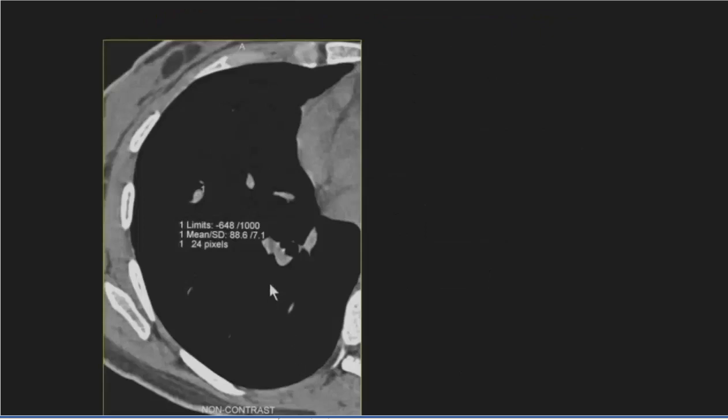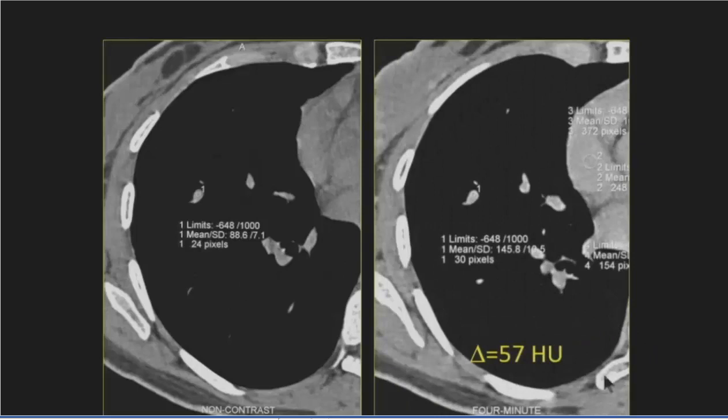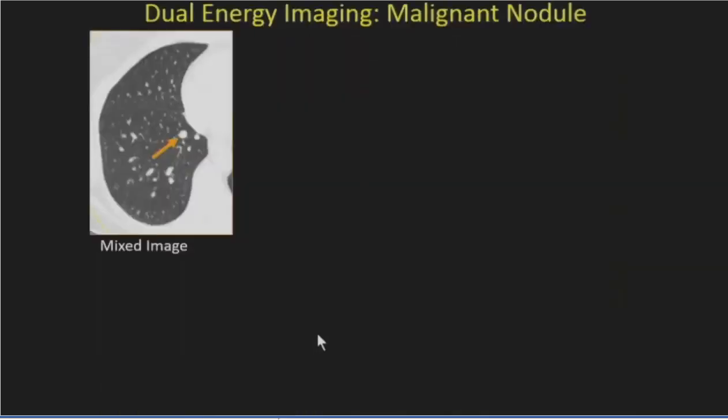This is just one example in which nodule enhancement was performed. It was a small lesion, on the order of 6 to 7 millimeters perhaps, and the nodule enhancement was shown to be 60. And this was kind of high, and so we thought that this could potentially be a carcinoid tumor. It was along an airway, and this was a small peripheral carcinoid upon resection. Now, it could be a granuloma, true, but in this individual, the suspicion with this morphology was that of a carcinoid given that airway location.